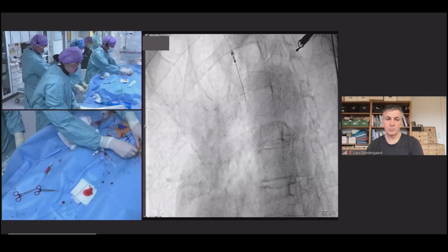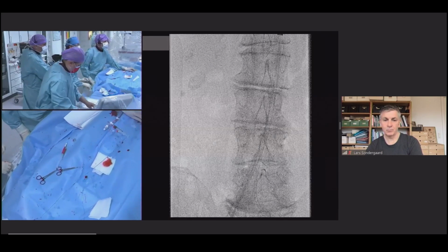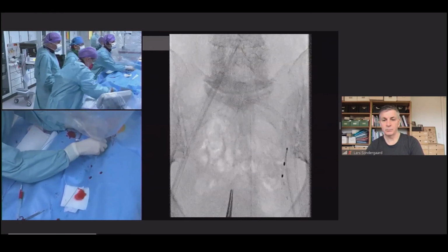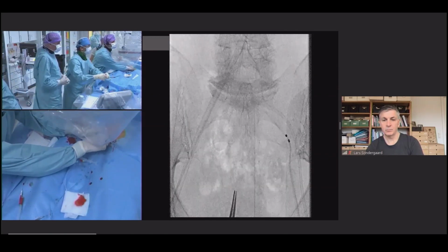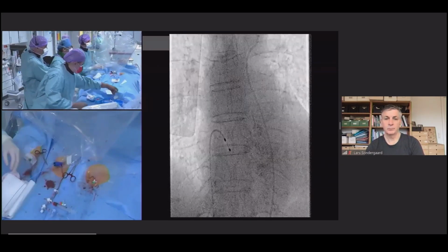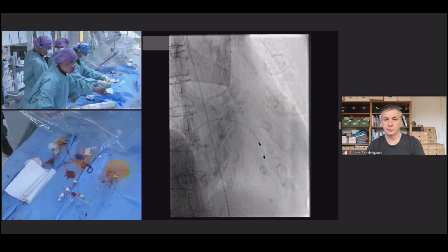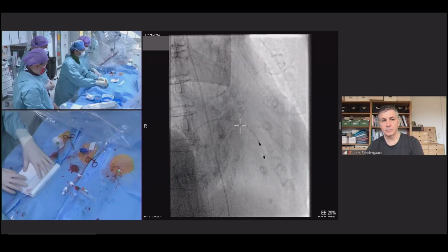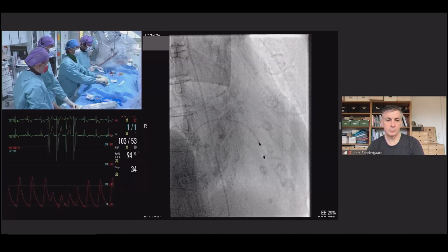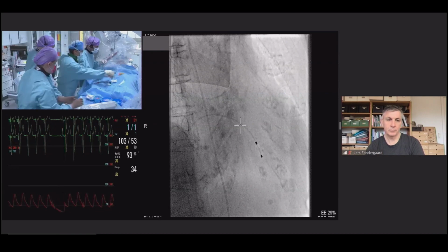Nice, yeah. Okay. Next we'll introduce the RV pace lead. And again, as I said before, this patient has incomplete right bundle branch block, so that's why we want to have an RV lead instead of doing LV pacing. So we can check the pace. If you pace 100 in a second, so start pacing. What's the output? Okay, good capture. That's fine. Okay, come off pacing.